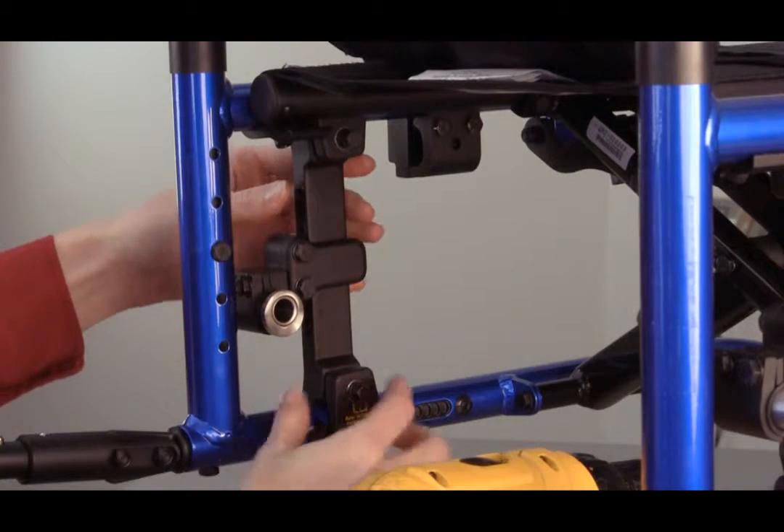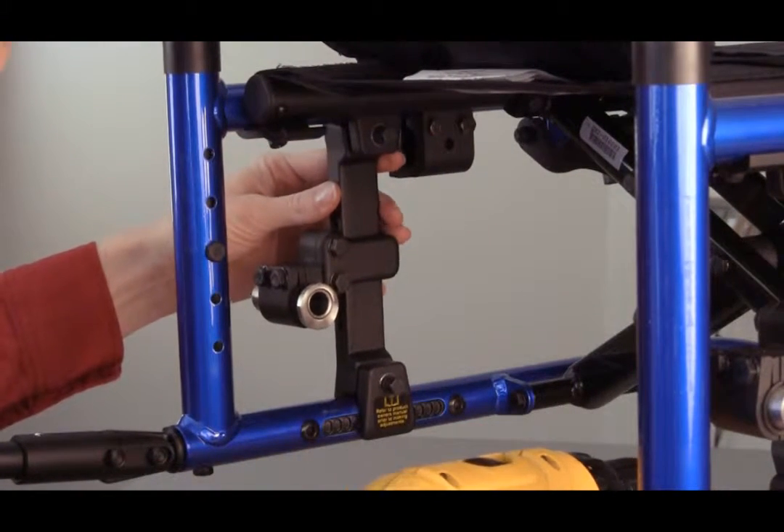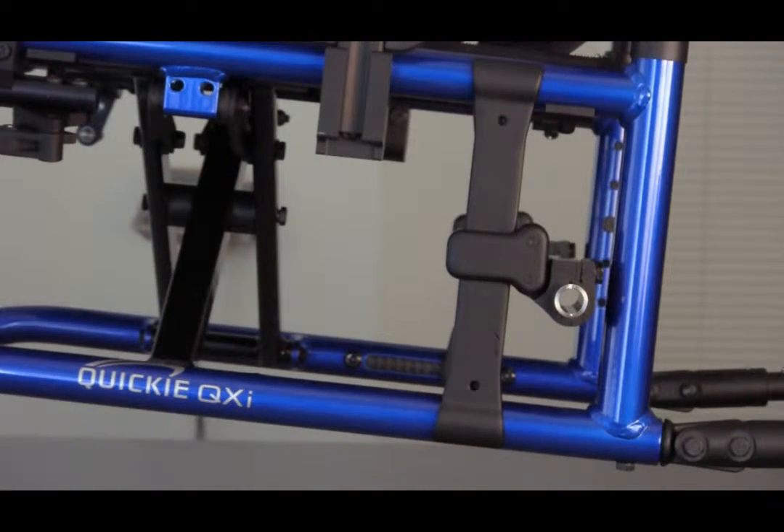The Quickie QXI is equipped with an adjustable axle plate for center of gravity and seat-to-floor height adjustments. The chair ships from the factory with the specified rear seat-to-floor height and the one-inch center of gravity position. This means that the axle receiver is located one inch in front of the back post.